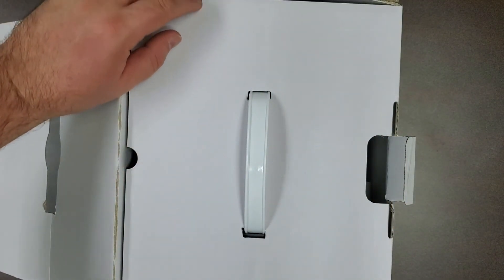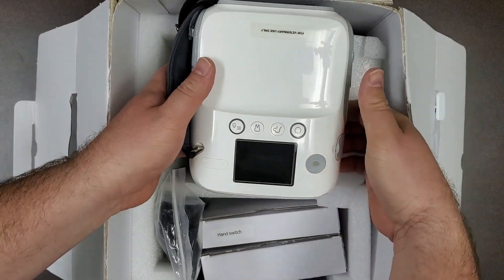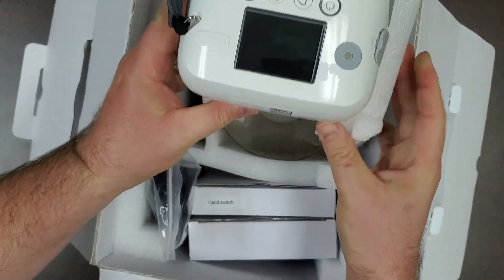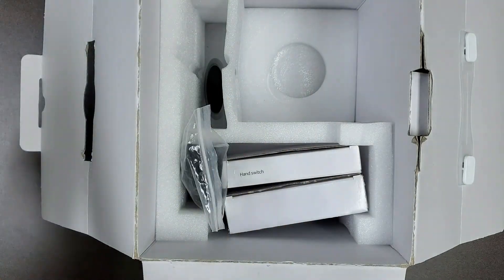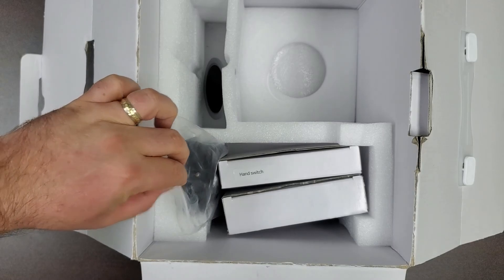Upon opening your Vetport X4 box, you will find the main unit generator. Removing the main unit from the box and taking out the packing foam below will reveal the radiation backscatter shield assembly. In the side section, you will find a box containing your charger with its accompanying adapter and a box containing the hand switch for your unit.